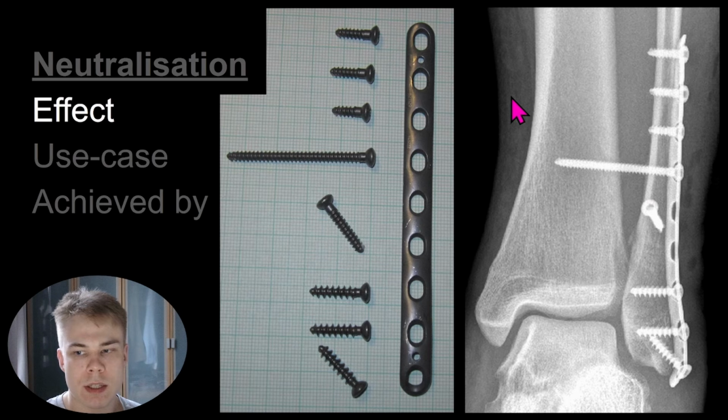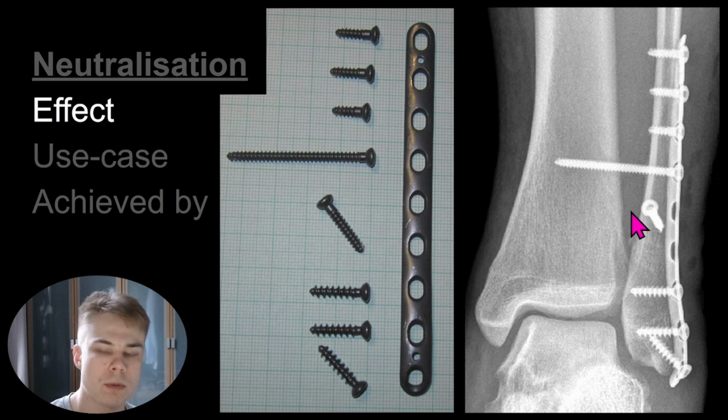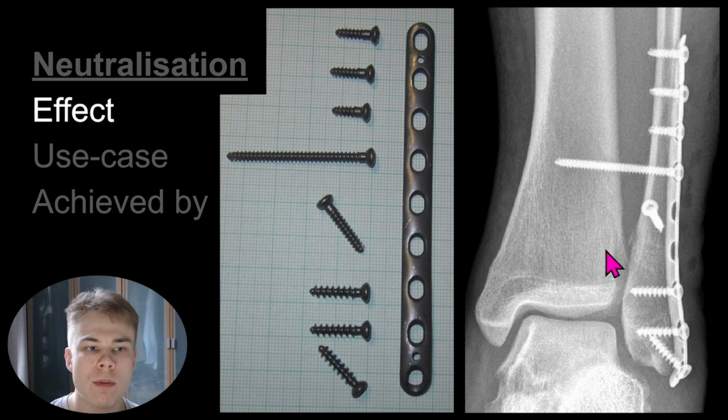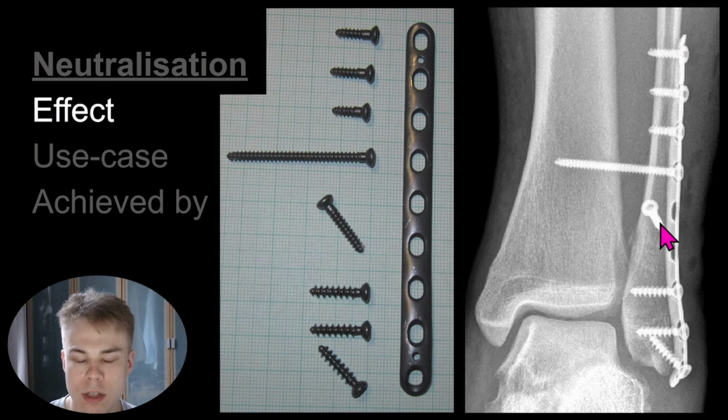What it basically does is you've got this fracture and an oblique fracture with a screw going through the fracture site, and it's in lag mode, which means that the screw actually pulls the distal fragment towards the proximal fragment, or rather it pulls the far cortex towards the near cortex. But that's vulnerable to shear forces, because if you imagine load going through here and the fracture is oblique, then that's going to cause a lot of shear force and it can cause construct failure. So basically this plate has screws on either side of the primary fixation device, and that helps share the load.